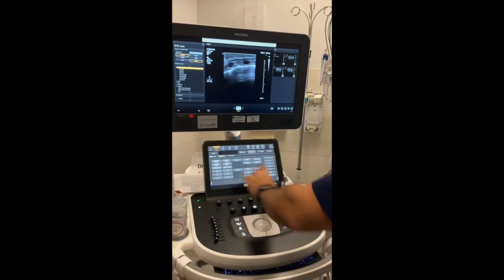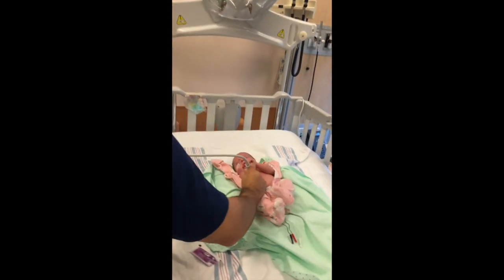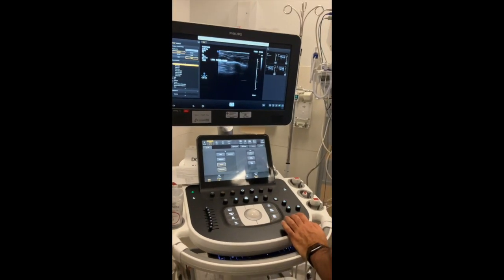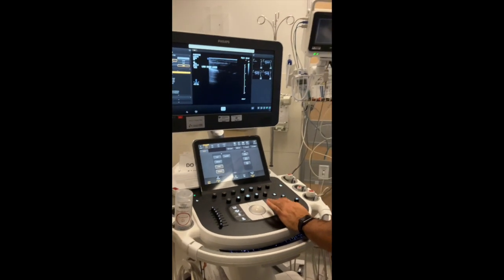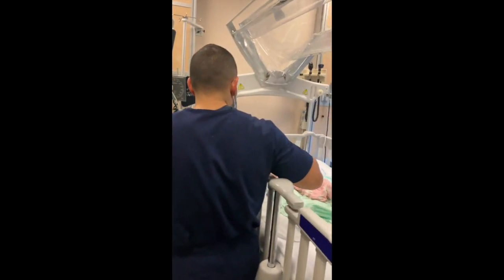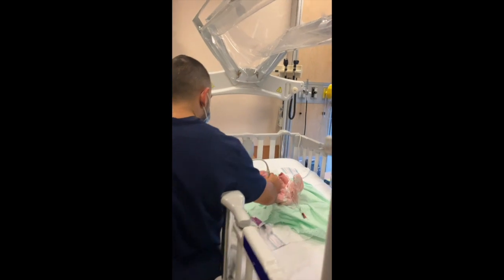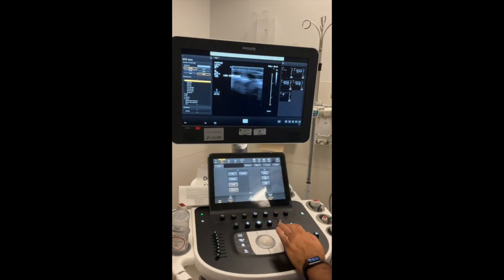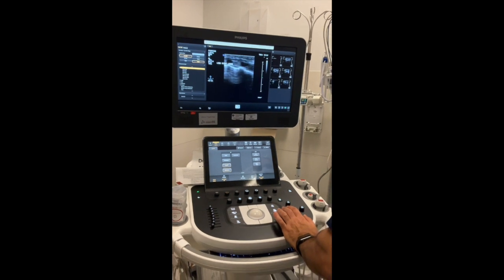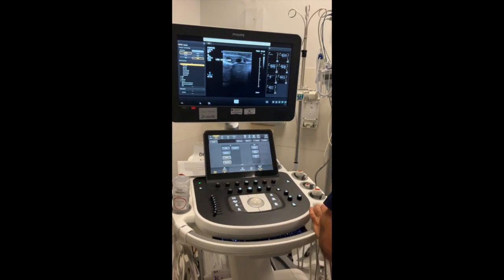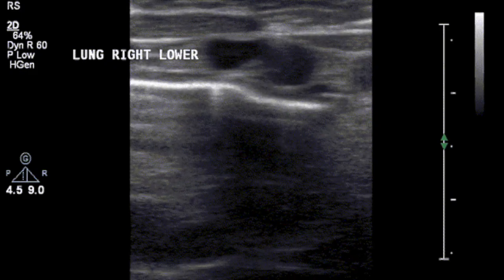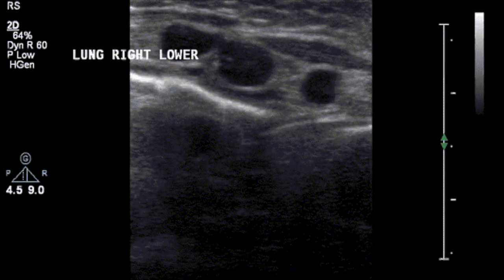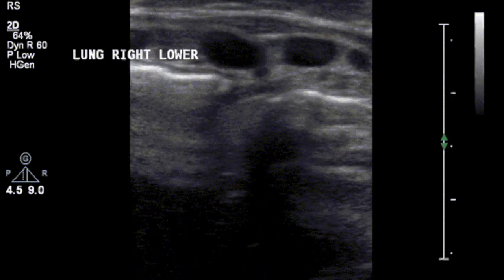I'm going to go to my second spot, which is the right lower lobe. I slide towards my lower chest. I start my five-second loop and go down on the chest up to the diaphragm. I start around the nipple line, mid-clavicular, and then go down until I see my liver and diaphragm. Here we see the clip in slower motion where we slide from the nipple line to the diaphragmatic margin — ribs in cross-section, A-lines within the pulmonary parenchyma, and eventually the diaphragm with the liver.